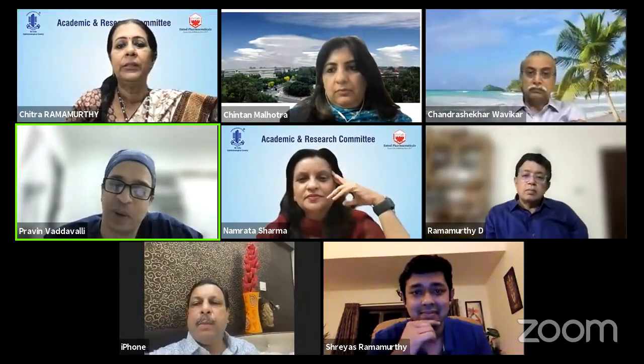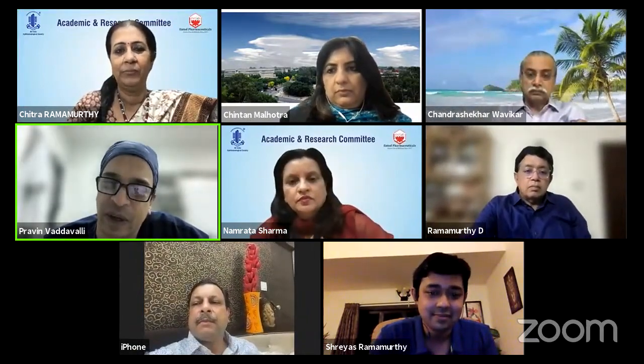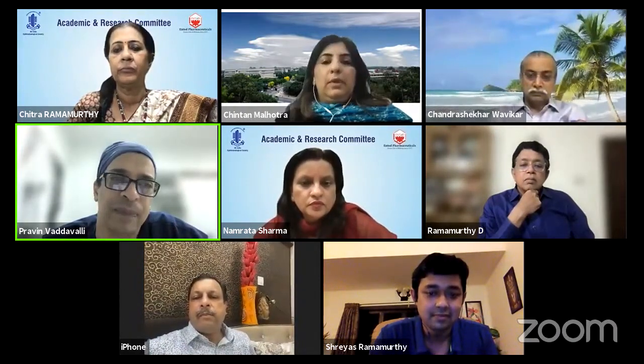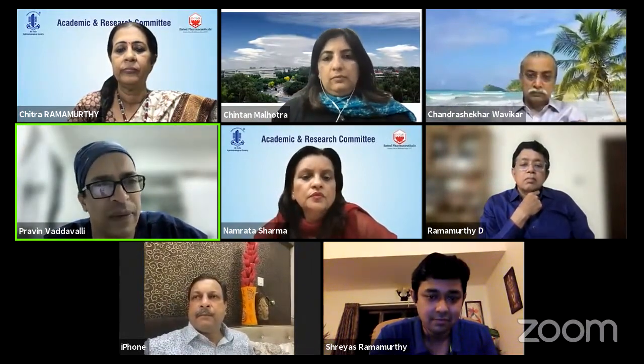I just wanted to appreciate Shreyas for the amazing study, especially the one on phakic IOLs and keratoconus. It generally seems that they're not the first choice for most patients with keratoconus, because you would expect that contact lenses probably would do a much better job. But other than spectacle correction, is there anything else that you would do to assess suitability for these patients?